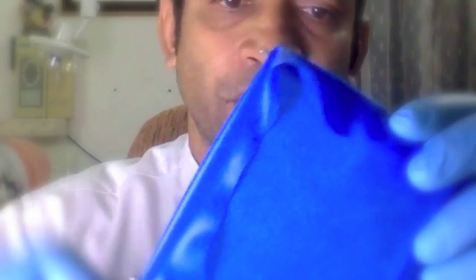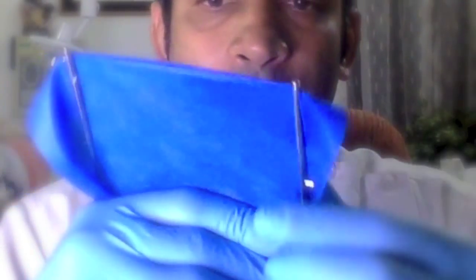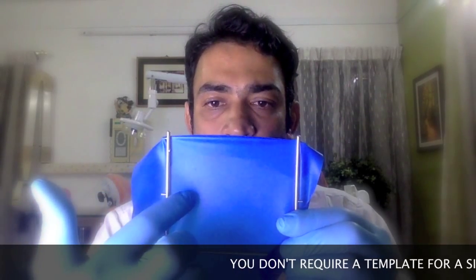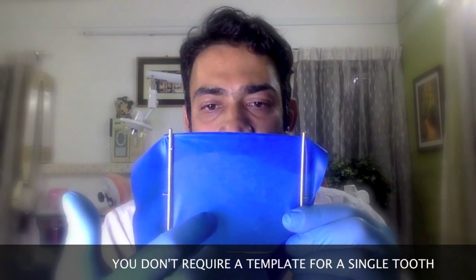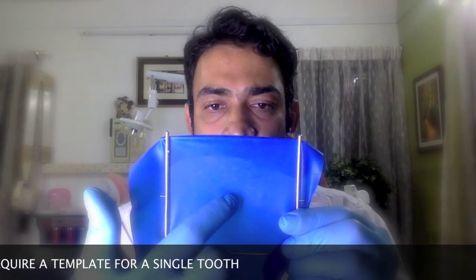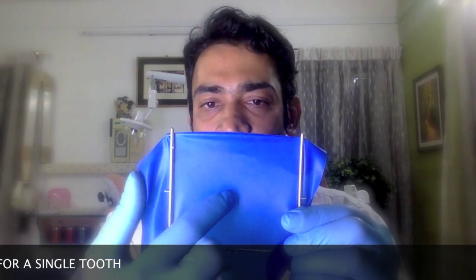Take your rubber dam punch. If you're doing a molar, take it to the largest hole. You can just turn this around and choose which hole you want, and then proceed to make a punch hole roughly in the center of the frame, slightly skewed to the side of the tooth that you're treating. So just imagine you've got the four quadrants here — let's say you're treating a right side lower molar. Then since this is the center point, you'd make your hole slightly skewed right. You don't really require a template.